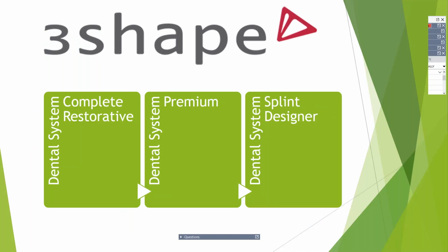Real quick, let's get some of the kind of technical information out of the way. So you might be asking yourself, so I have 3Shape, can I use Splint Studio? Or you might be asking yourself, okay, I don't have 3Shape, what do I need to get? What do I need to purchase to be able to use the new Splint Studio? So there's really three options here. Dental System Complete Restorative and Dental System Premium both will have the Splint Designer module included. So if you have either of those or you purchase either of those, you're going to be all set.